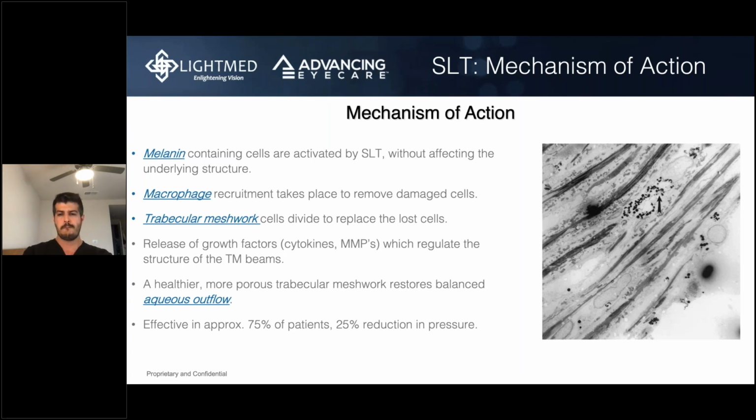Have you ever done an SLT treatment directly on the limbus, that is without use of a gonio lens? So why do we use a gonio lens? Because of total internal reflection. If I were to shine my slit lamp and try to look at the gonio, I will not be able to do that, which is why gonio lenses were created. So the answer is no.